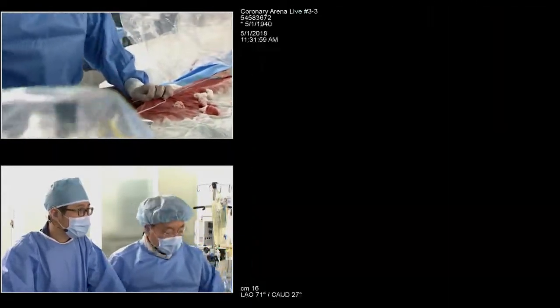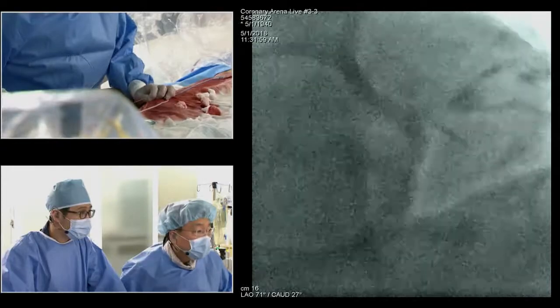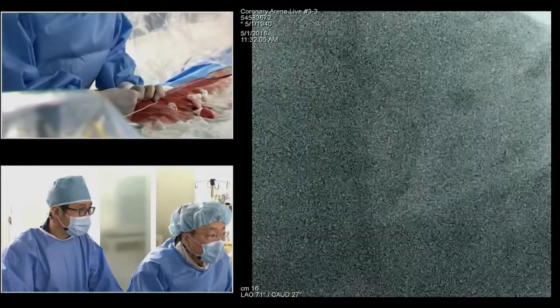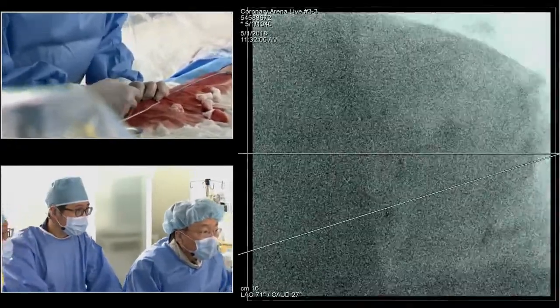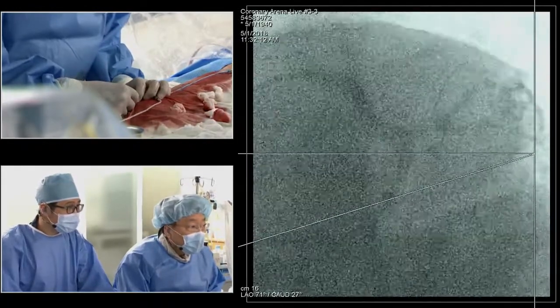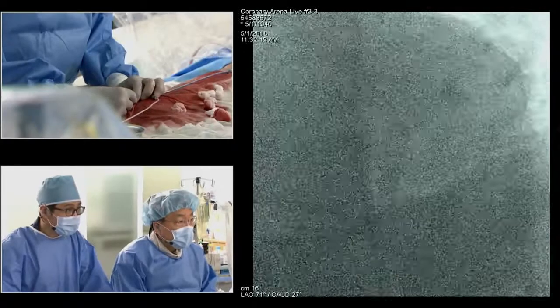All right, picture here. Okay, I will do a little bit further outside. I don't see full coverage of the ostium. That is my test, please. Even some part of a proximal stent is hanging out. I think the clinical endpoint is quite, not too much.